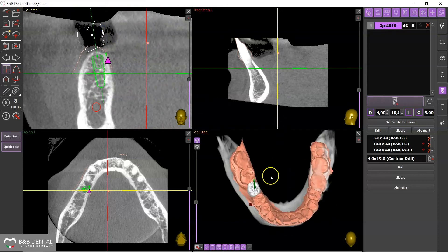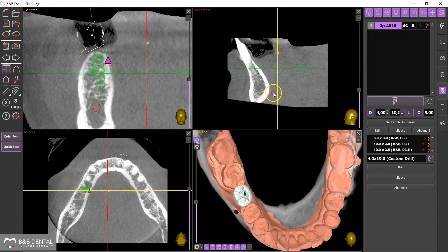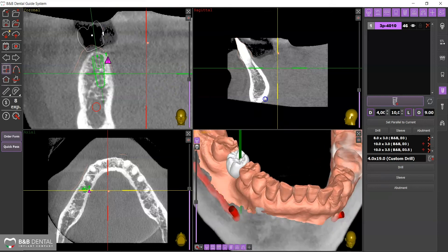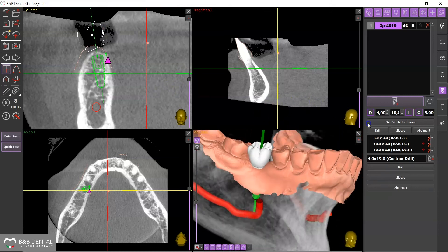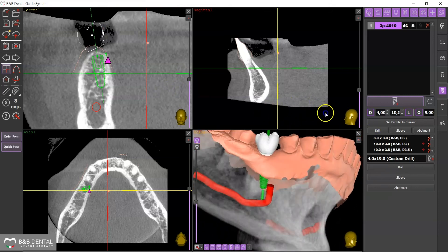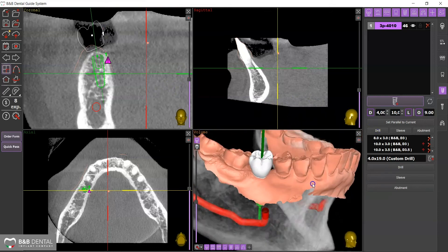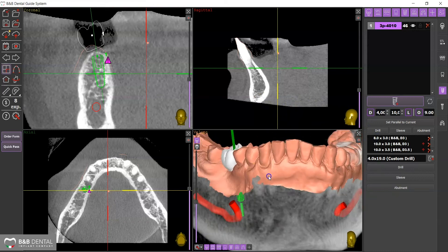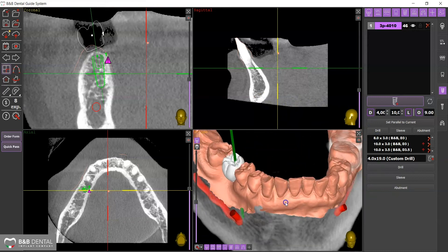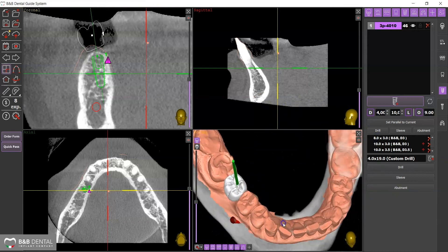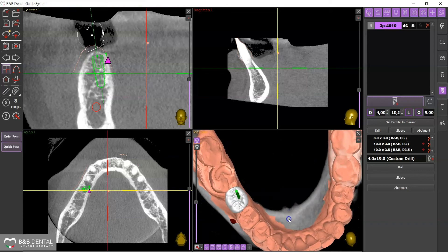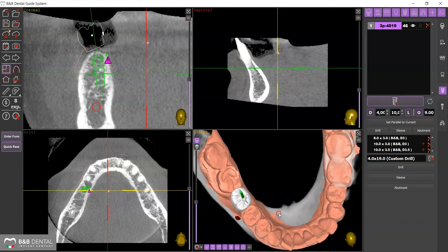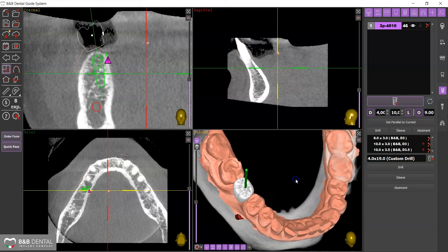In the volumetric display, you can also evaluate the axis of the implant in accordance with the position of the previously inserted tooth. At the bottom, you can activate or deactivate the different elements to have a more or less free field.